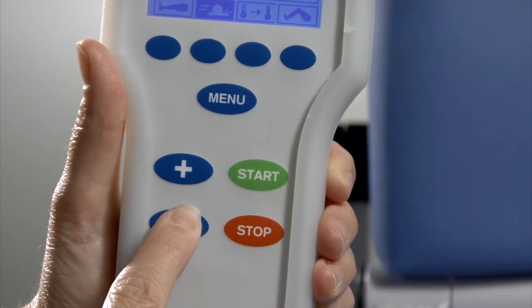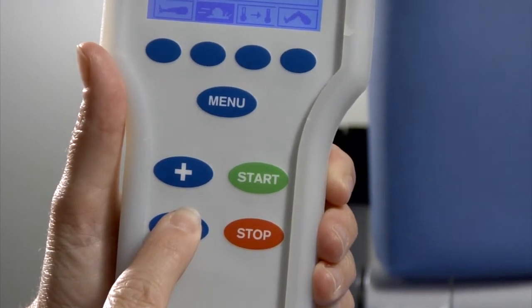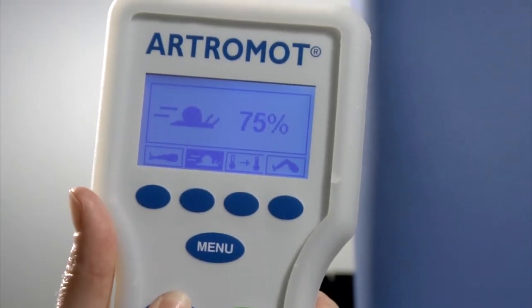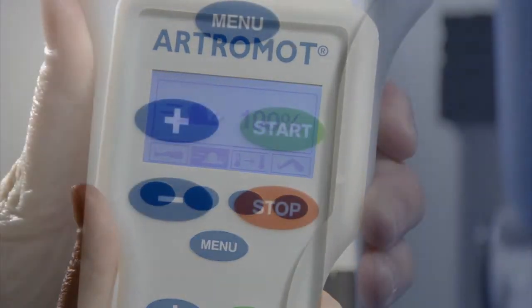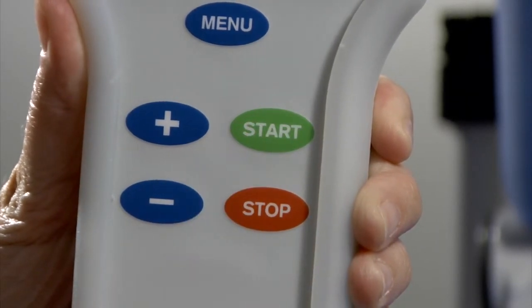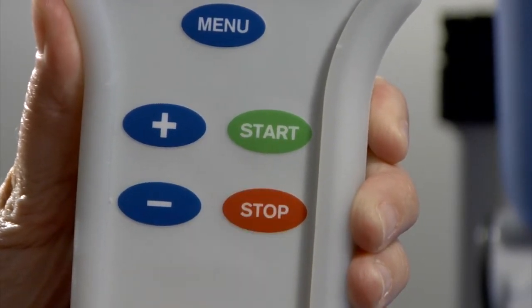The machine should be set at a comfortable speed for the patient, keeping in mind that the more passive repetitions that the patient is able to go through, the better. The stop and start buttons are clearly marked on the hand control and perform their stated functions.